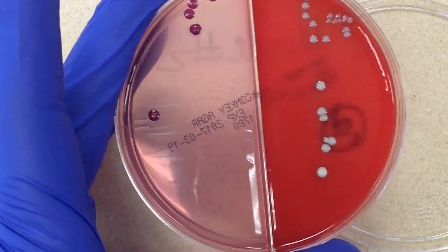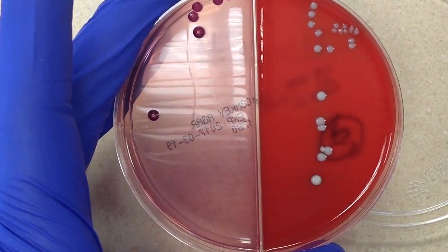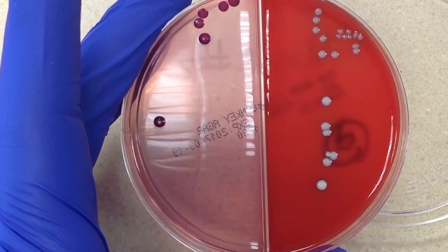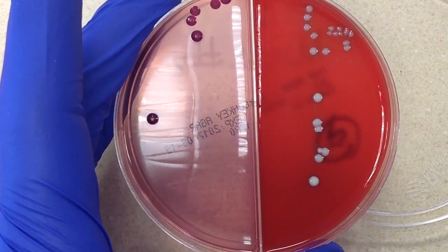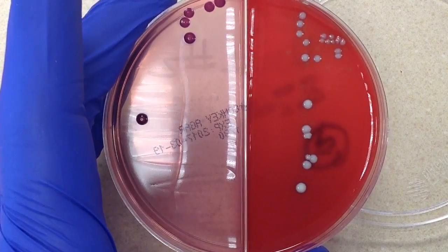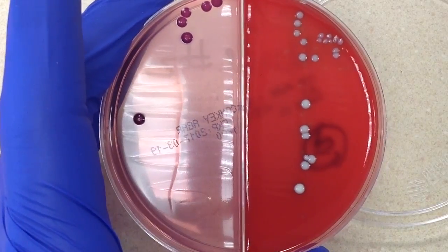Assuming that it's a clean catch specimen, I would report this one out differently from the previous one. In that case I said 30,000 to 40,000 mixed gram-positive organisms and greater than 100,000 E. coli. Here there's nothing that's really predominant, so I'm not going to make that distinction. What I'm going to say is probably 20,000 to 30,000 mixed organisms — or mixed gram-positive and mixed gram-negative organisms — and then plate held for seven days.